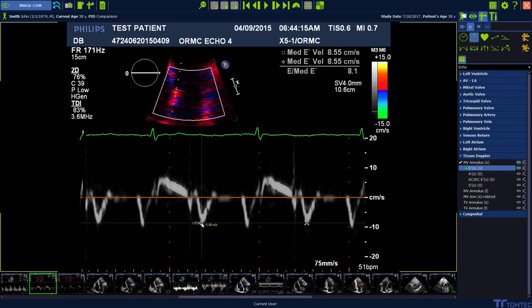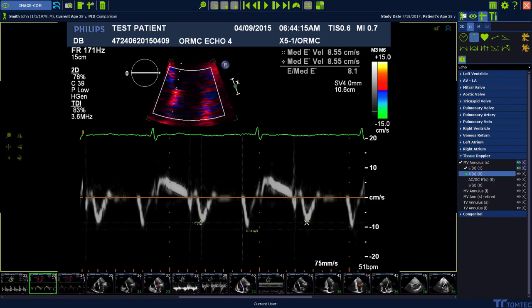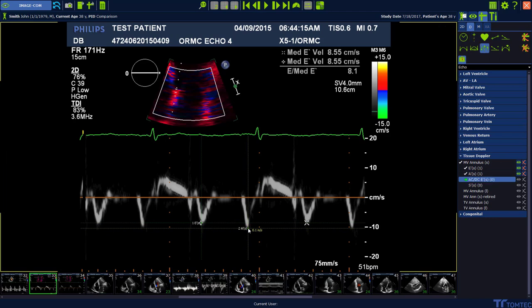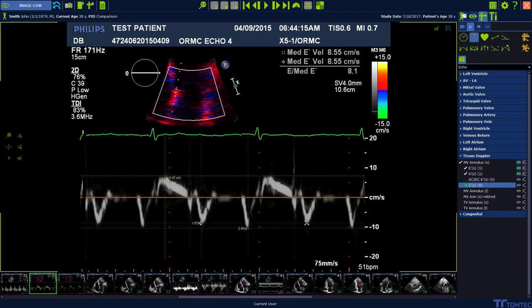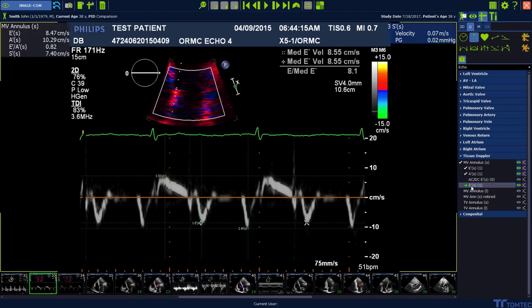Press the keyboard key N to get the next measurement or to skip measurements in between. Proceed with S'. Move the mouse over the measurement package to visualize the values in the left upper corner of the image region.